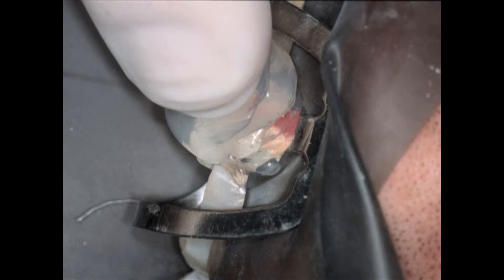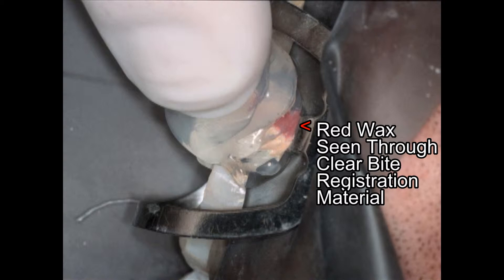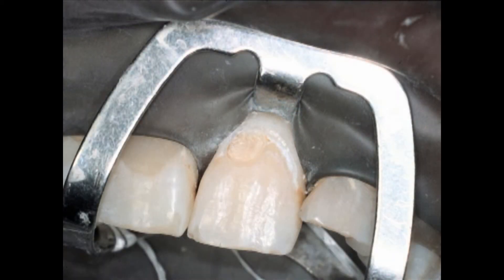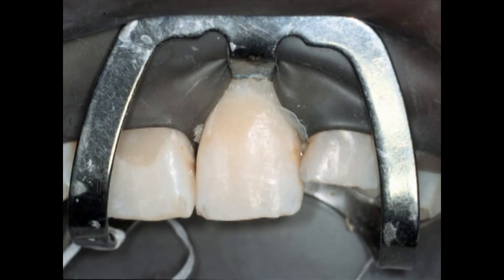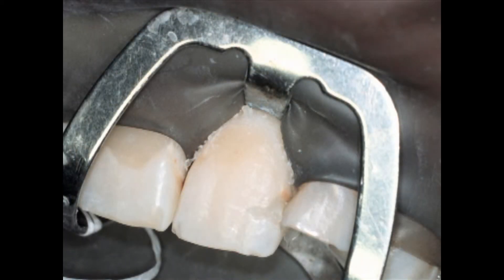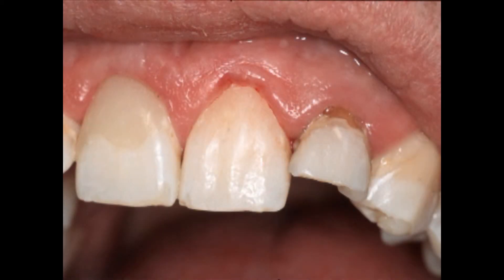Here we are — that slide got a little cockeyed, but that's okay, you can get the idea. You can see the red wax in here. Here's our prep. Light cure. Notice the flash on this rubber dam over here — that won't stay there, that flicks right off. We've got some flash down here, again not a major problem, especially if you don't acid etch that area. We've removed the flash with my favorite composite shaping instrument, my number 12 blade, and here's our finished composite.